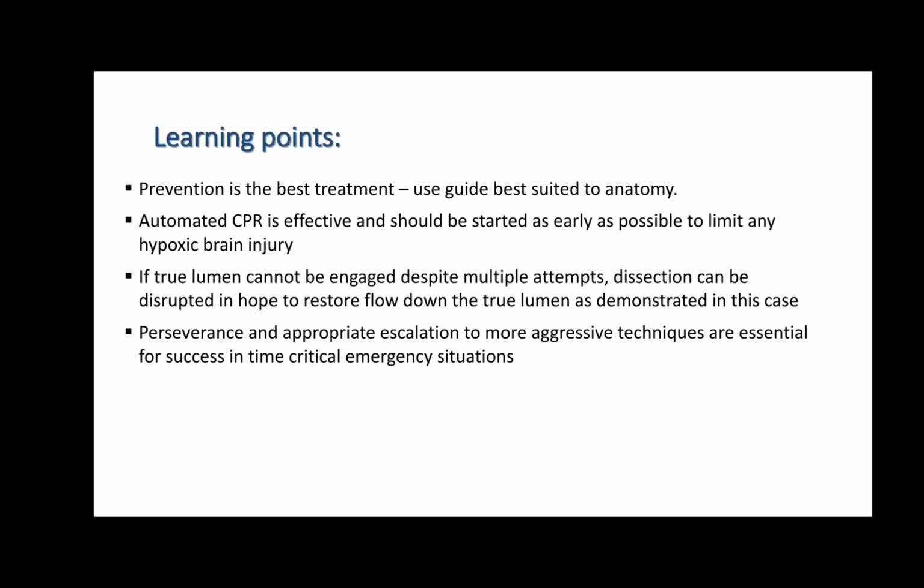Let's say the lesion is in the LAD, and the guide catheter is pointing to the circ. You can wire the circ even though you don't need it, then pull back the guiding catheter and have a second wire with a bigger bend to go to the LAD. What I'm trying to say is a guide wire can help stabilize the guiding catheter position, and you may not need aggressive maneuvering.